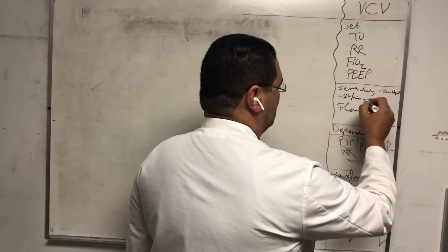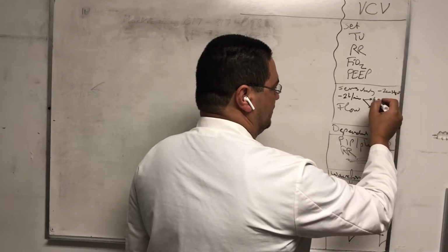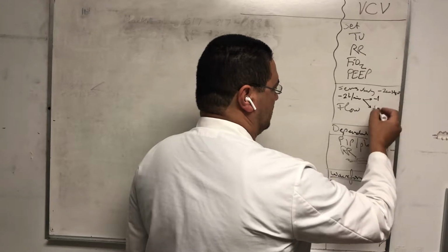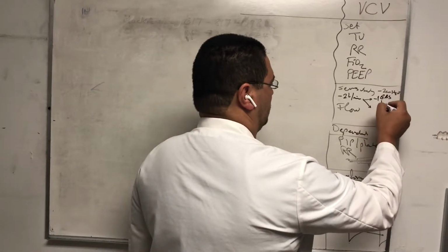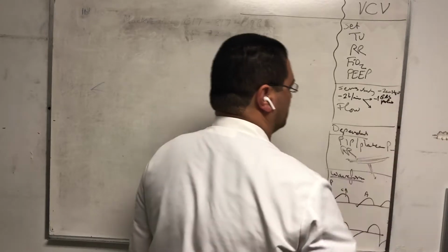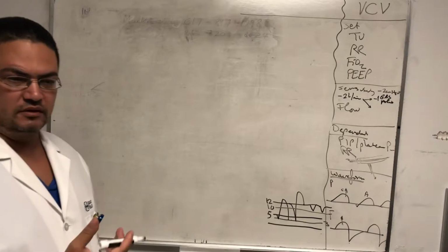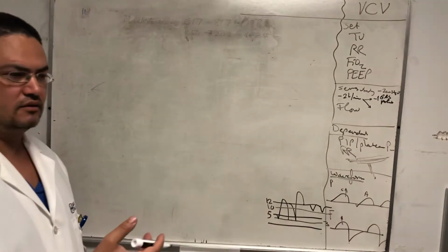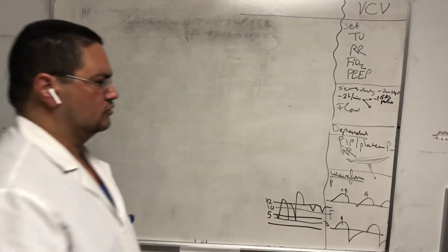That made COPDers actually easy to intubate and extubate, no big deal here. But -2 liters per minute can be too much for some people, patients who are very, very weak, and for that reason we have to drop it to -1. These patients have Guillain-Barré syndrome, polio, critical care myopathy. You're obviously not going to extubate them, but they probably need to be trached, and to be comfortable and awake, you have to decrease the triggering to -1.